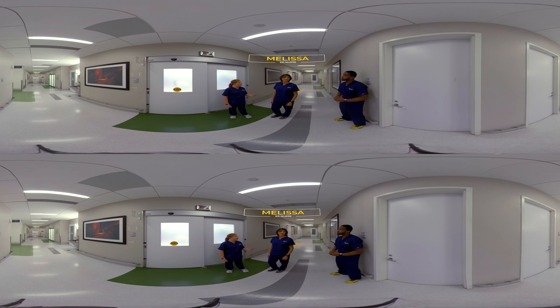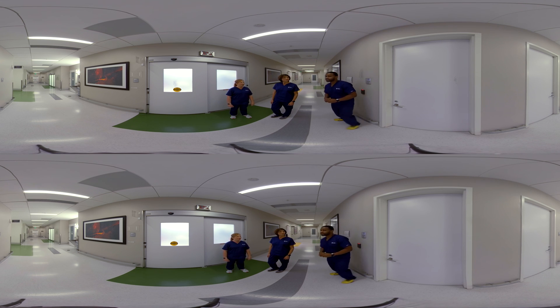When we go in, Melissa, can you grab the Arctic Sun device? And can you get some Arctic gel pads and a core temperature probe? All right, let's go.